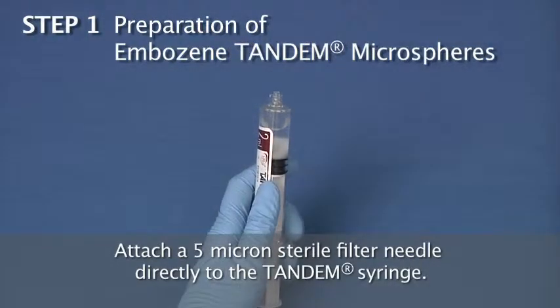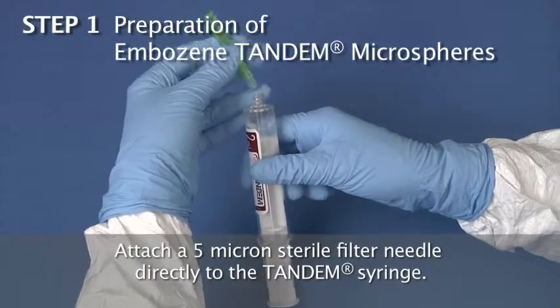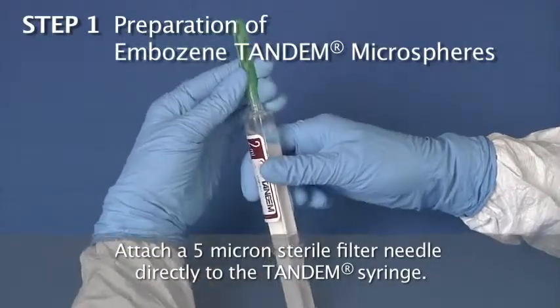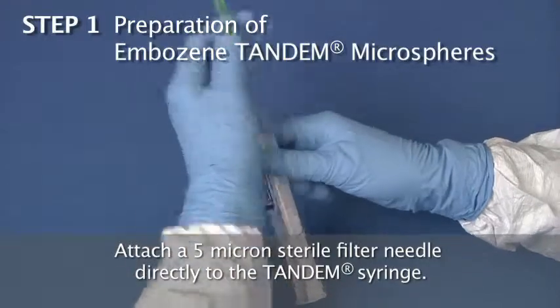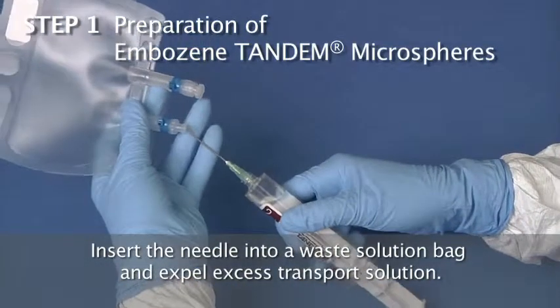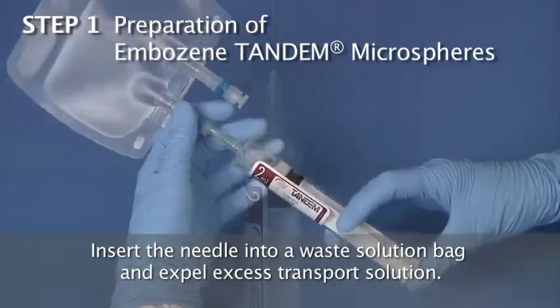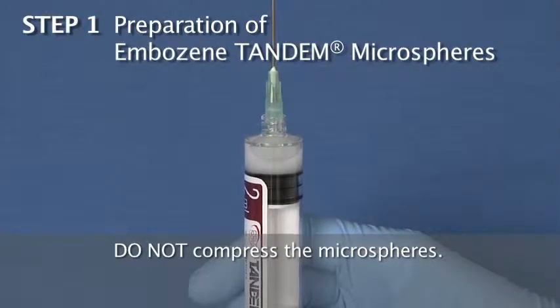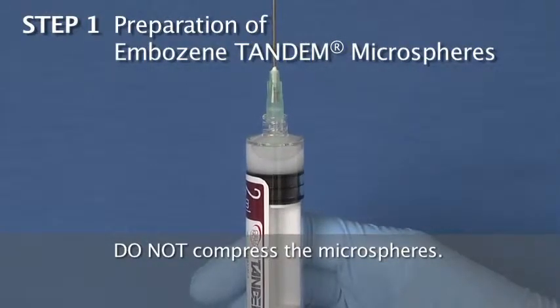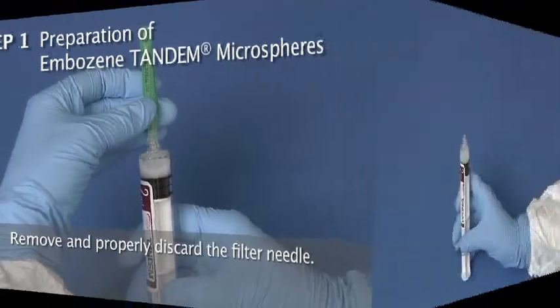Attach a 5-micron sterile filter needle directly to the tandem syringe. Insert the needle into a waste solution bag and expel excess transport solution. Do not compress the microspheres. Remove and properly discard the filter needle.